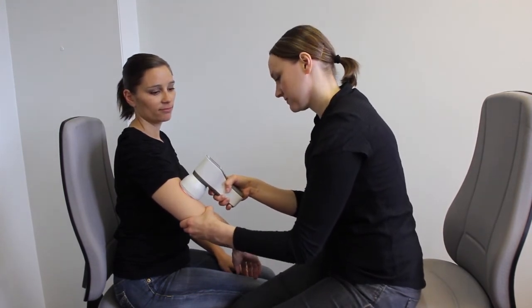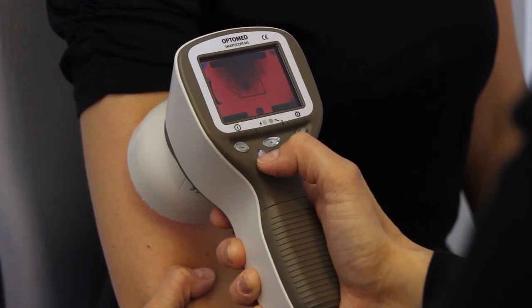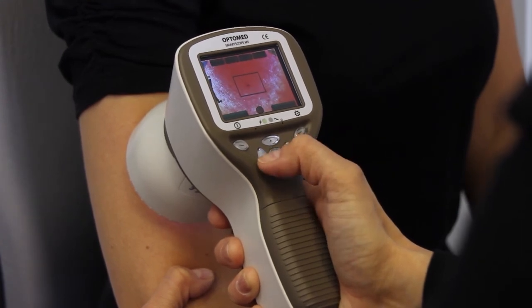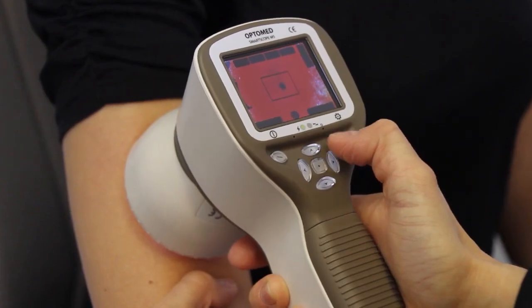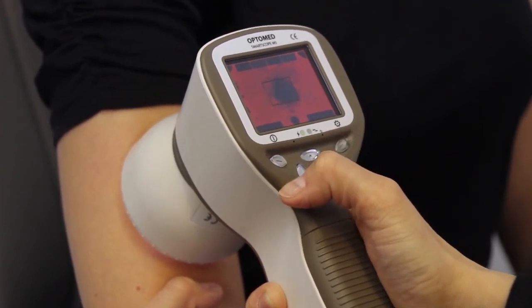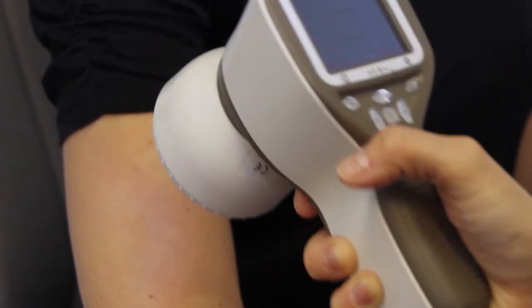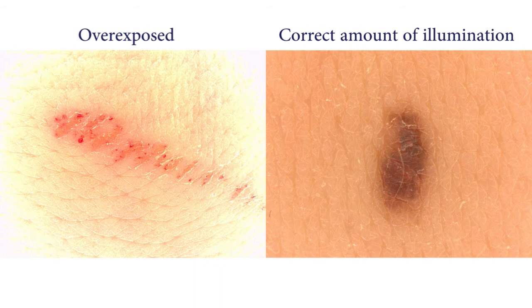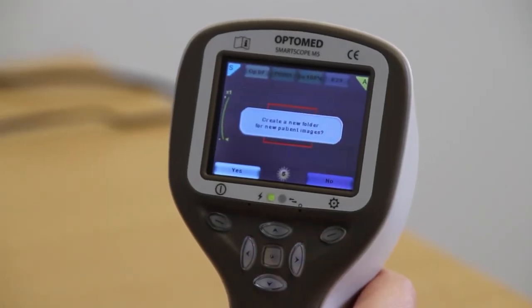You may use immersion fluids as well as aqueous disinfectant. Adjust the illumination settings by using the left and right arrow keys. Be careful not to overexpose the image. If needed, activate zoom by pressing the right soft key and use the arrow keys up and down to adjust the zoom. Capture the image by pressing the shutter button. In order to ensure best quality, you should take multiple images during each examination. If multiple patients are examined during one session, create a new file folder for each patient by pressing and holding the middle key.